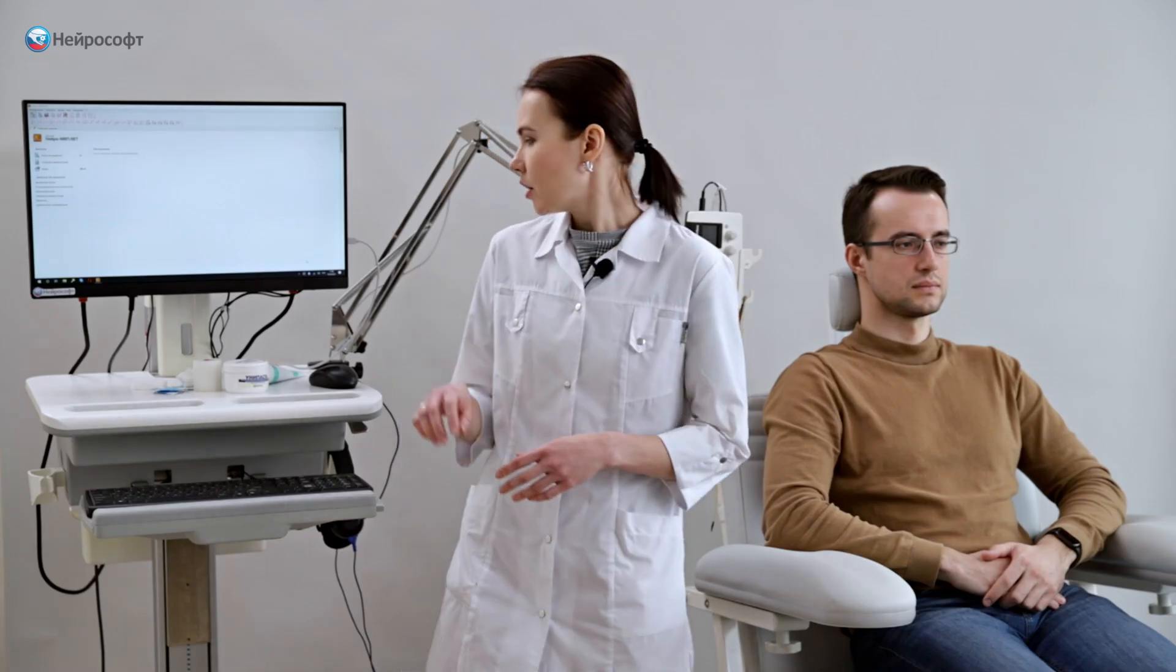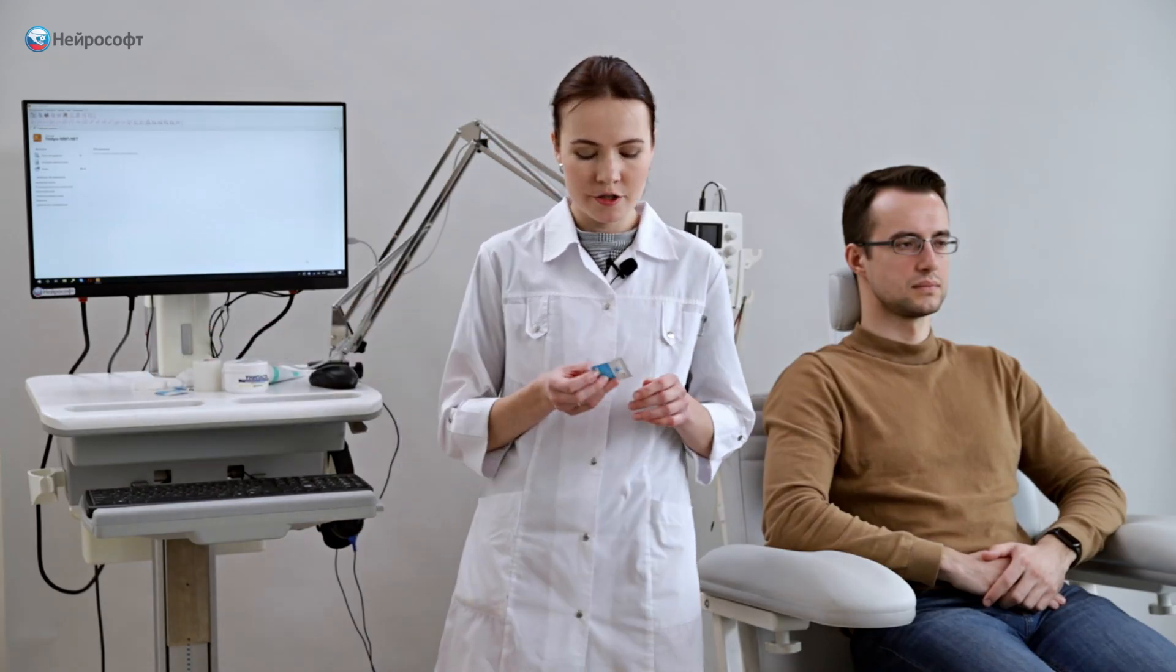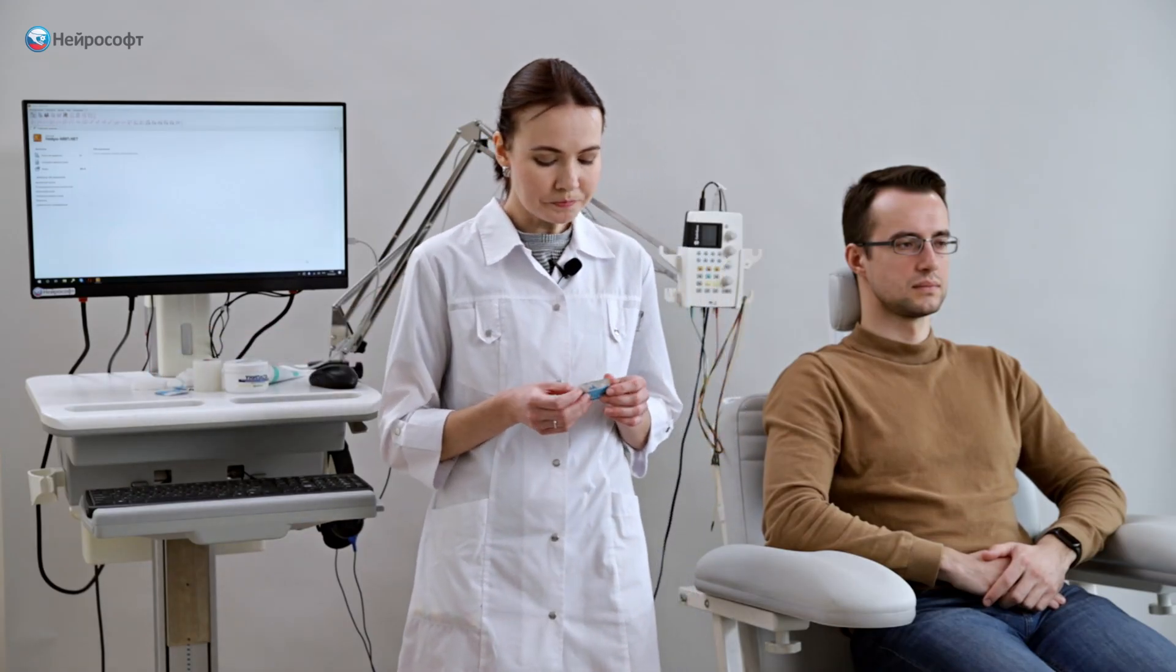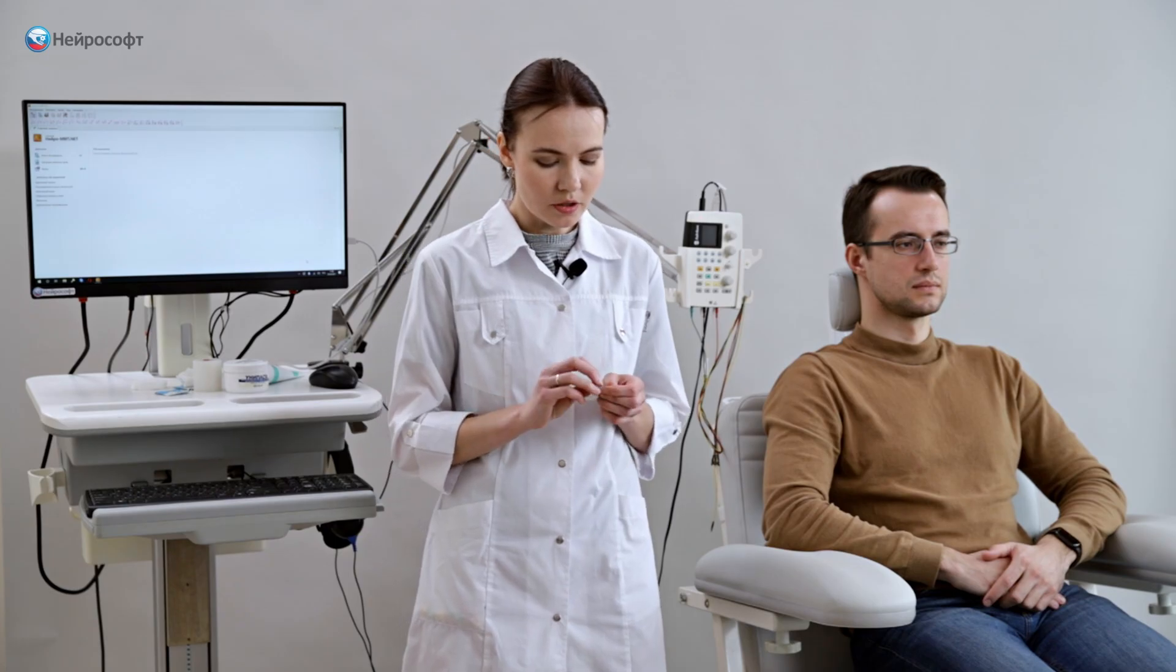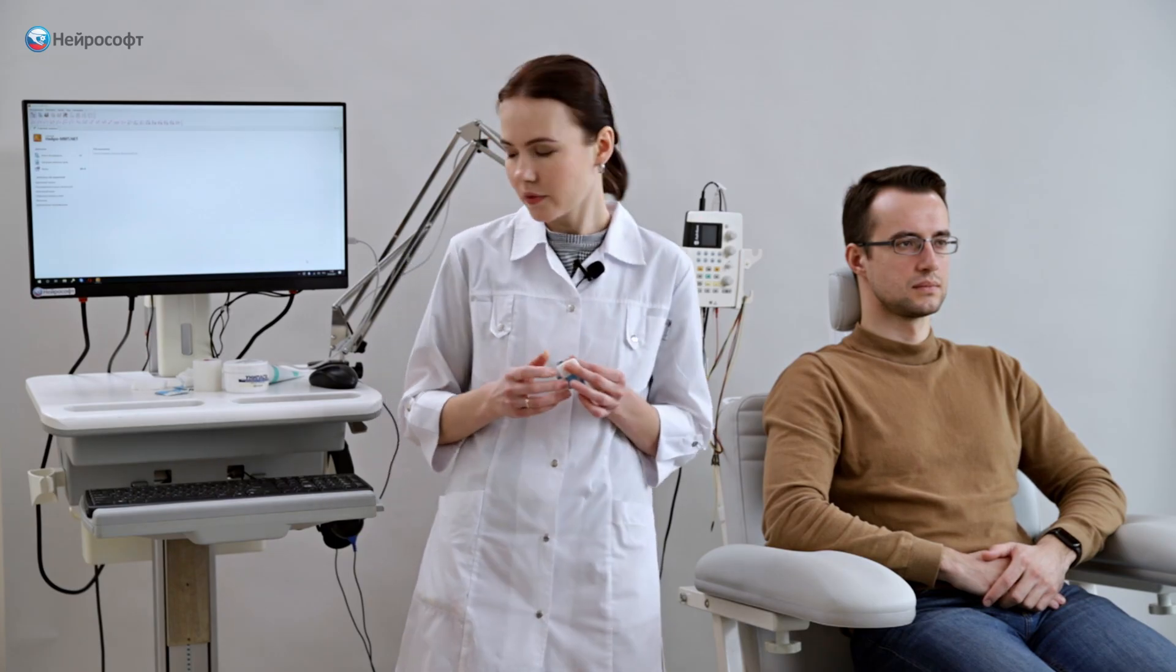We need to prepare the patient's skin. The places where we will position the electrodes, according to the International System 10-20, must first be degreased and then treated with abrasive paste.